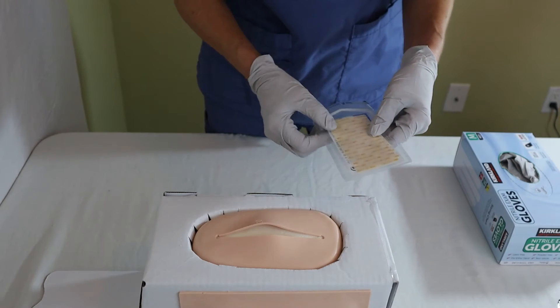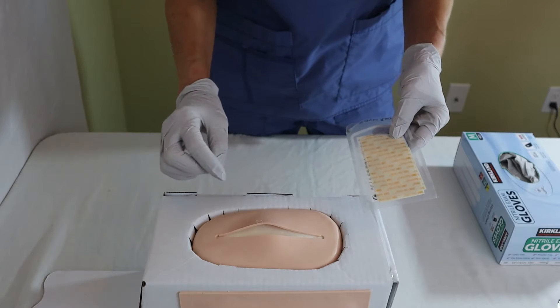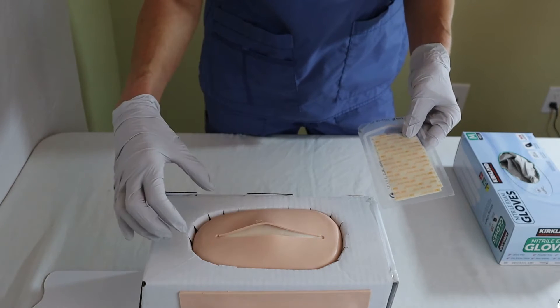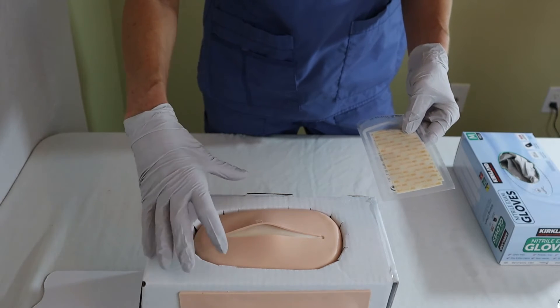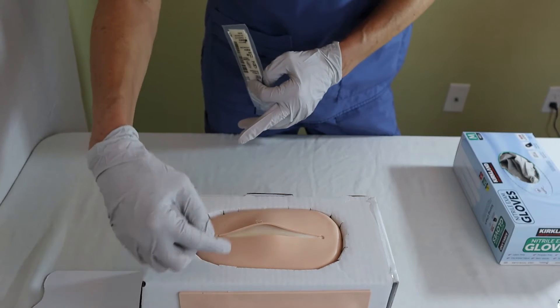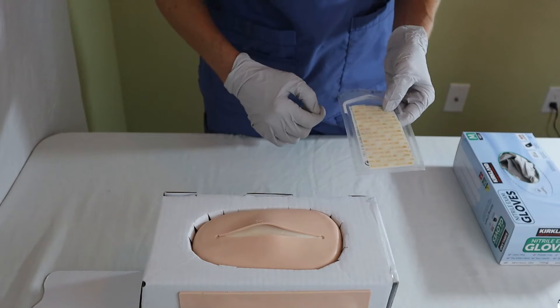We are going to apply these strips across the patient's wound, so we want to make sure we have enough to hold the wound together. But we also want to make sure we don't overlap too much because, like any tape or strip, it could irritate the patient's skin.